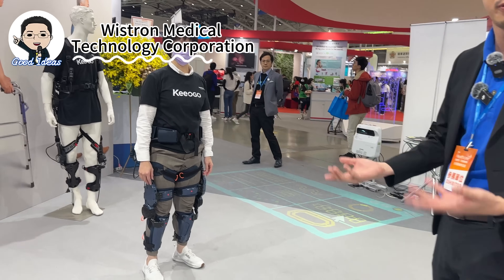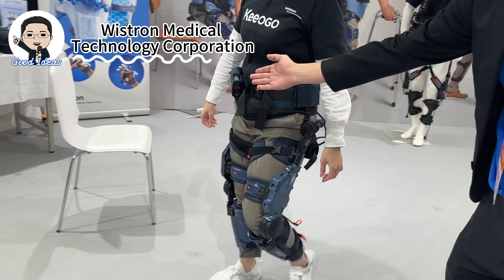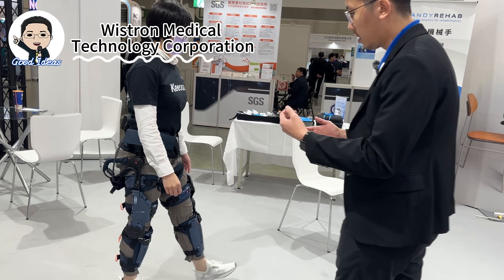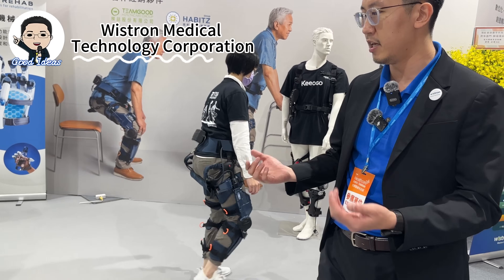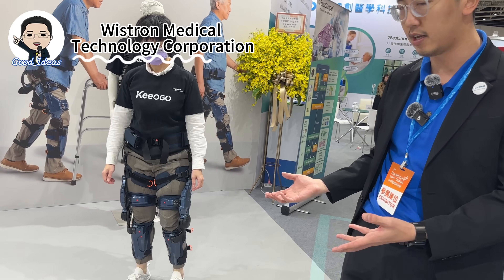You can see that she can wear the robot hands-free, and the robot will assist her motion and movement immediately, anytime, anywhere. The power is on and the machine will support her knee to do walking and lunging. No remote control or other device needed — just launch and the device will follow and provide assistance.